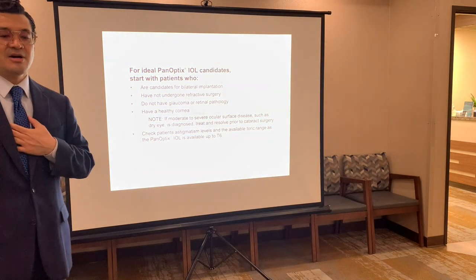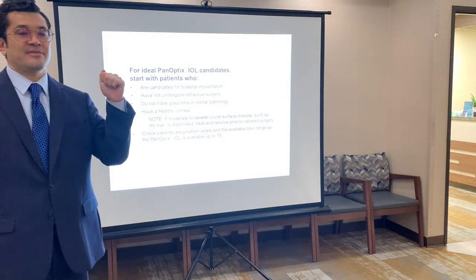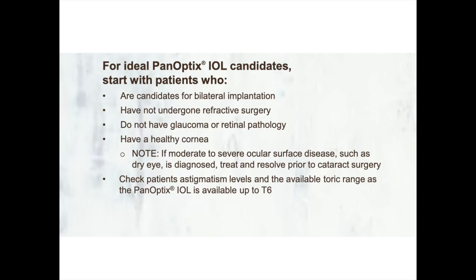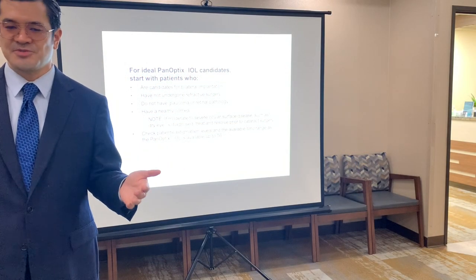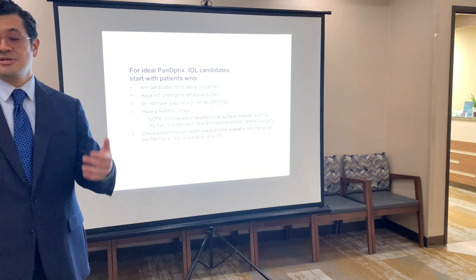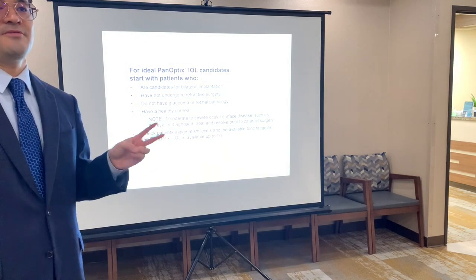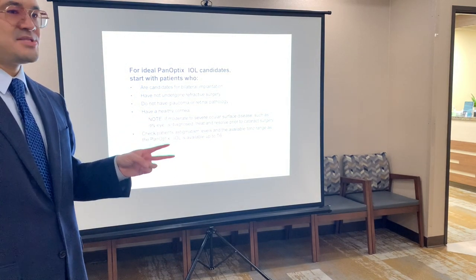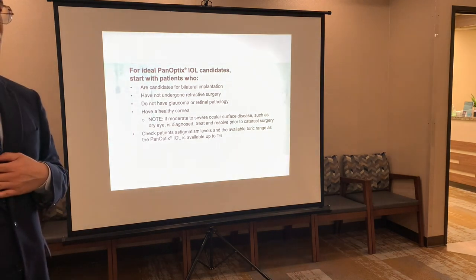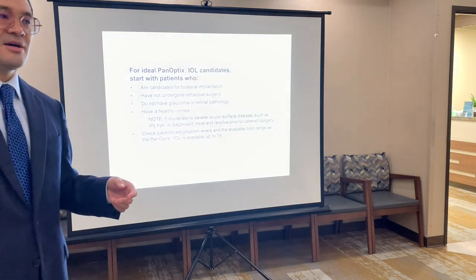So, when you talk to people, who are the best candidates for multifocal lenses? Usually it's someone who you're probably going to do both eyes, because it's hard to do just one, and then they have to wear glasses afterwards for the unoperated eye. Especially if they're going to do both eyes, because then you'd have the benefit of both eyes getting those zones of focus and the best depth perception. Two, if you're going to choose a multifocal lens, the ones that have a history of refractive surgery usually don't do as well. I found when we do a multifocal in our post-LASIK patients, they have higher side effects, interestingly.